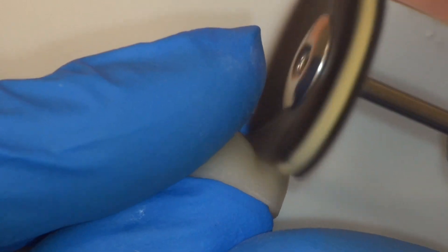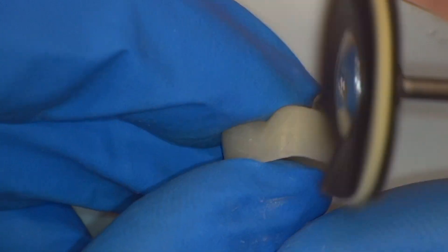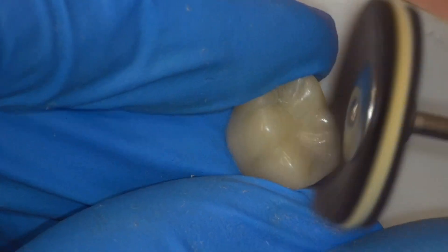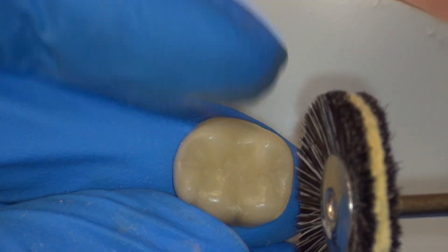The goat hair brush is employed at speeds of 5 to 15,000 rpm to begin refining the finish. We can already see an improved shine. Brushes are ideal for working on the occlusal surface as they can reach all of the grooves and anatomy. If you find that the brush is leaving dark marks on your temporary, the speed is too high.